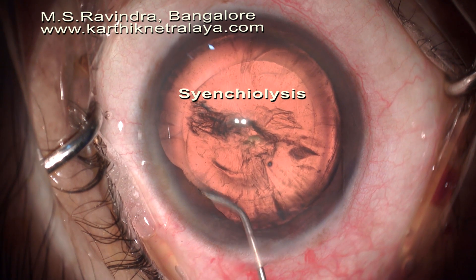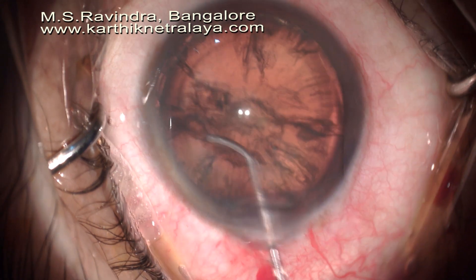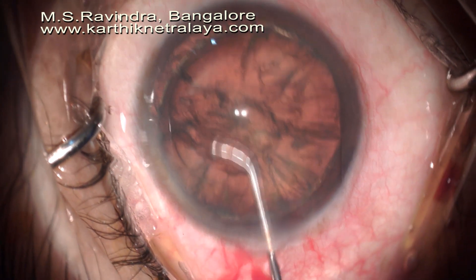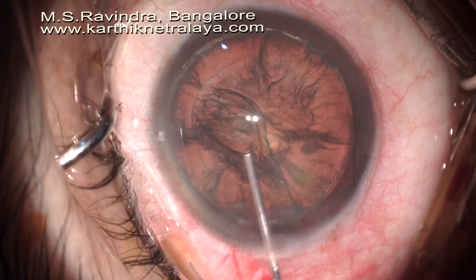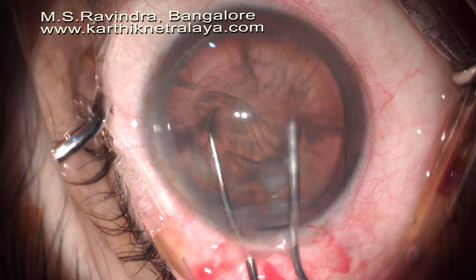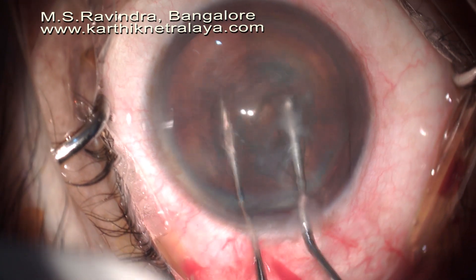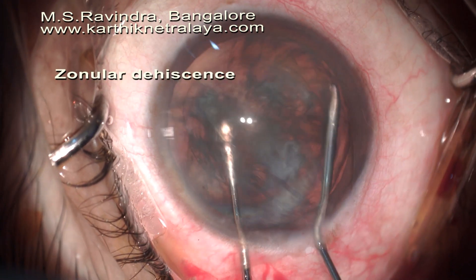I did a very careful segmental hydrodissection, wanting to minimize further damage to the already deficient zonular system. I did not push the cataract backwards — it is still shallow even now. I rotated the nucleus completely so that there are no adhesions between nucleus, epinucleus and cortex. You can see that from 5 o'clock to 9 o'clock there is a deficiency in the zonules.